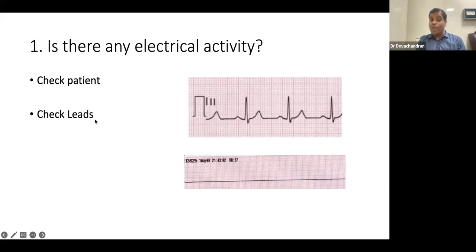If the patient is well, then check the leads. If the patient is unresponsive, then it is cardiac arrest, start CPR. So do you see electrical activity? The bottom one, there is no electrical activity. The top one, there is electrical activity.